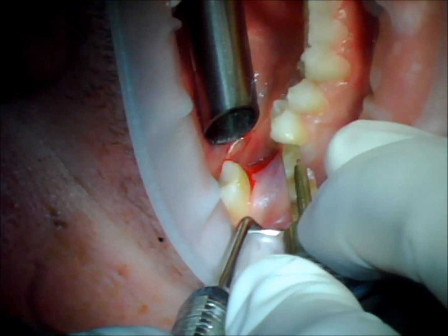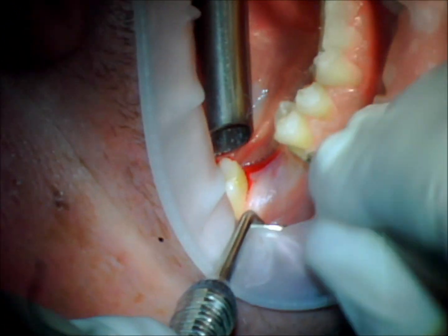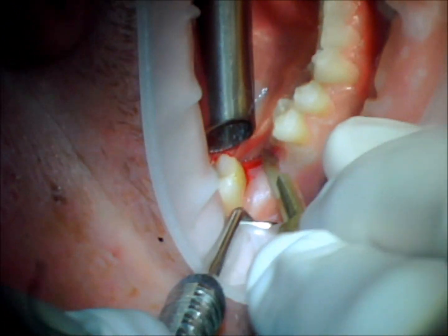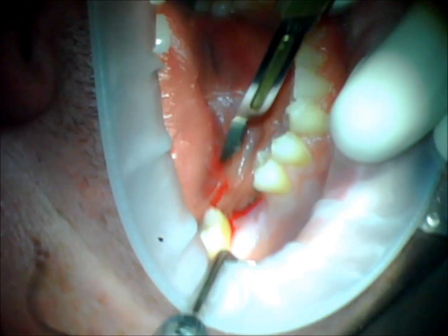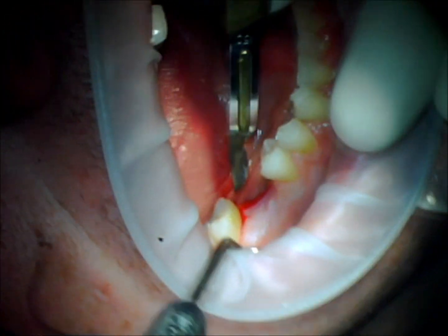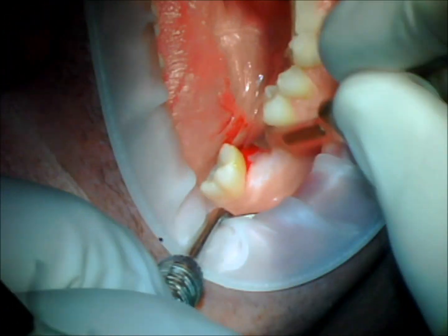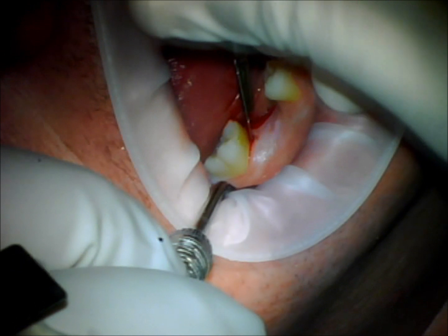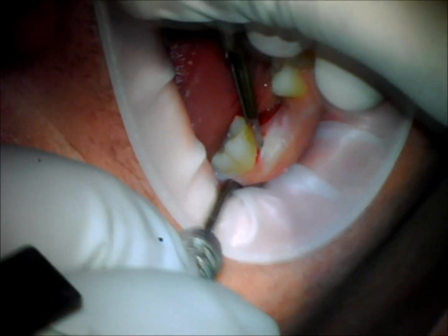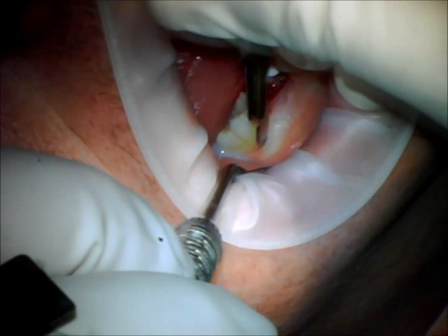You'll notice I used a curved scalpel blade to do the initial incision. Otherwise, there's no way to get access coming in from this way with a 15 blade. Just a little trick to help get access to make your initial incision.